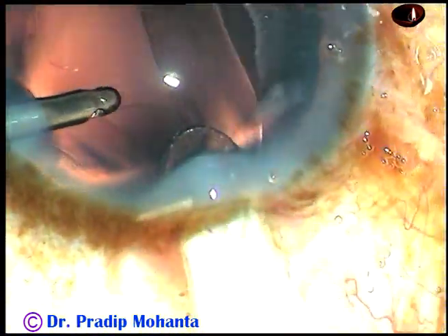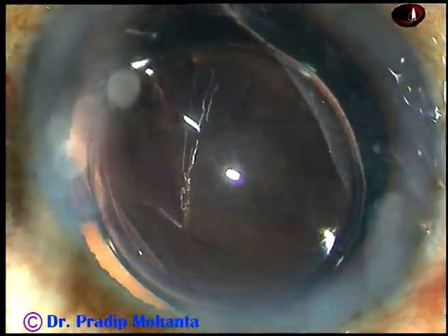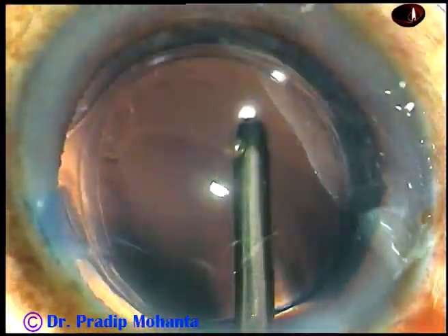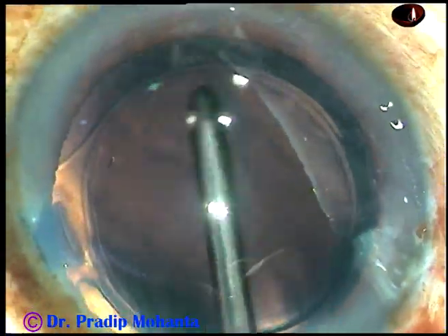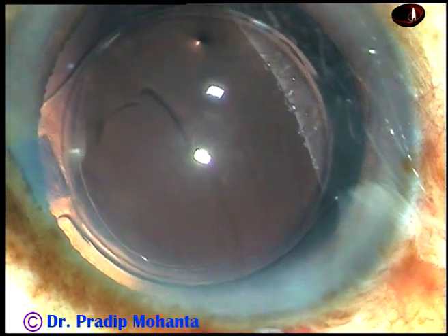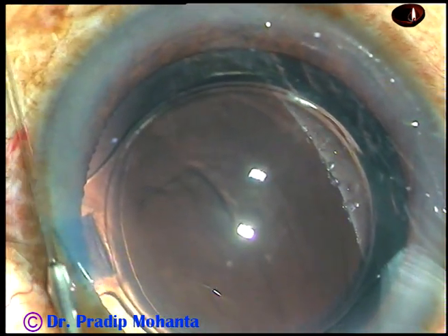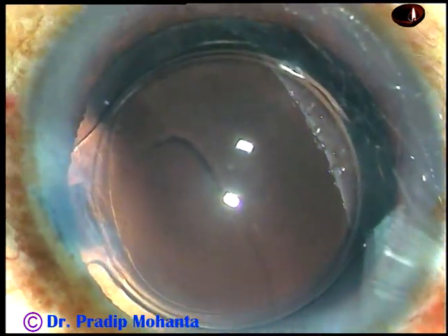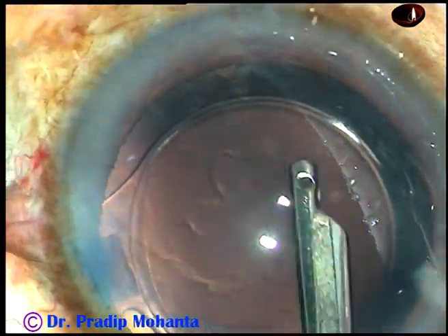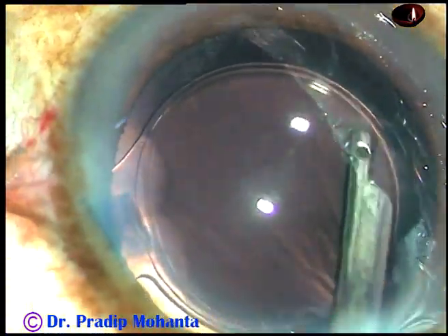This is hydro-implantation. The lens is implanted keeping the anterior chamber formed by irrigating fluid. And now, whatever viscoelastic was there in the lumen of the cartridge is irrigated out — it comes out through the main incision. And now, this is a bit of moxifloxacin. Then the side ports are hydrated to make these wounds waterproof. This is the final lavage of the anterior chamber. The cortical fibers at 6 o'clock are removed.